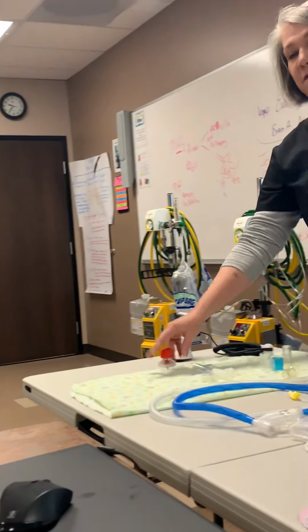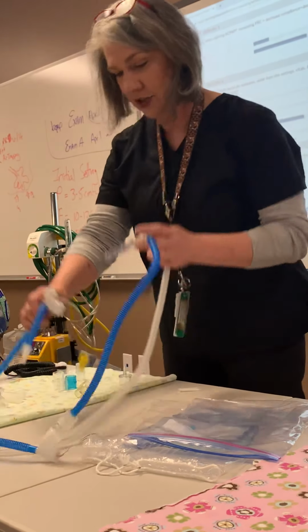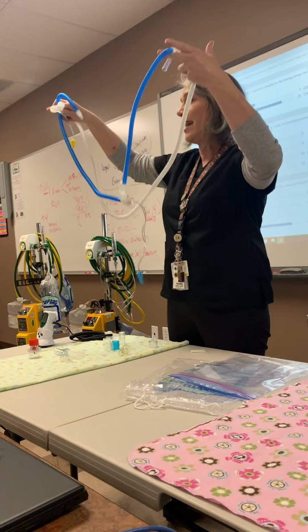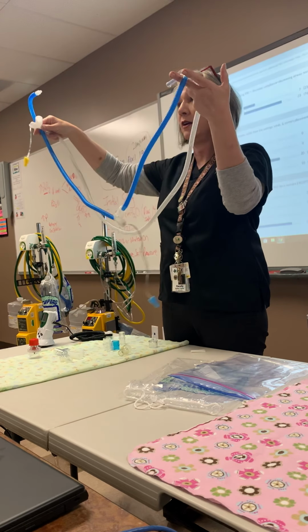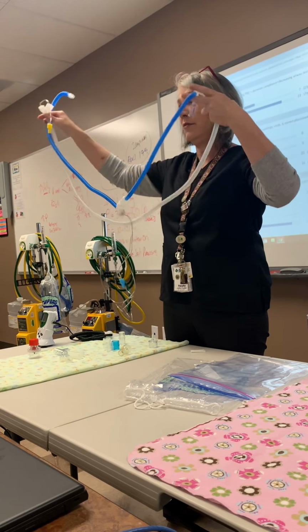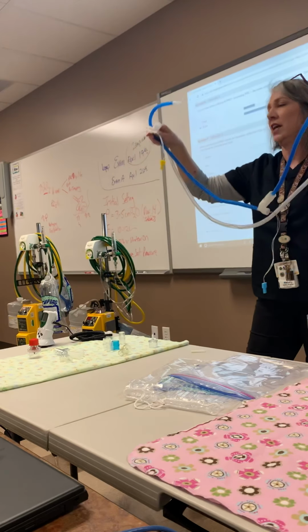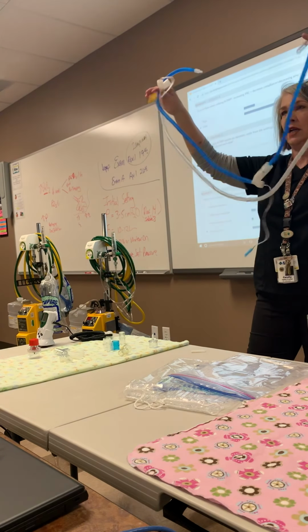So that's your pop-off. Heated wire neonatal circuit. Okay, so heated wire neonatal circuit. Here it is. How do I know it's heated wire? Well, I can look in the tubing and there's a heated wire in there. I can also tell because it has the prong adapters for your heater. This circuit and that concha, this circuit and the Fisher-Paykel, no go together. Okay, these are old circuits, those are old conchas, so just know this is your heated wire circuit.